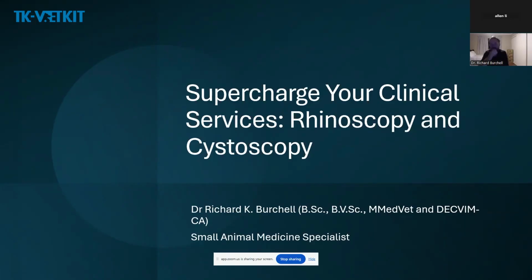The other thing is that if you are offering these services in your clinic, you really are differentiating yourself, particularly with cystoscopy, because if you're able to evaluate the urinary tract without doing surgery, that represents a significant diagnostic advantage over the more invasive traditional diagnostic modalities.